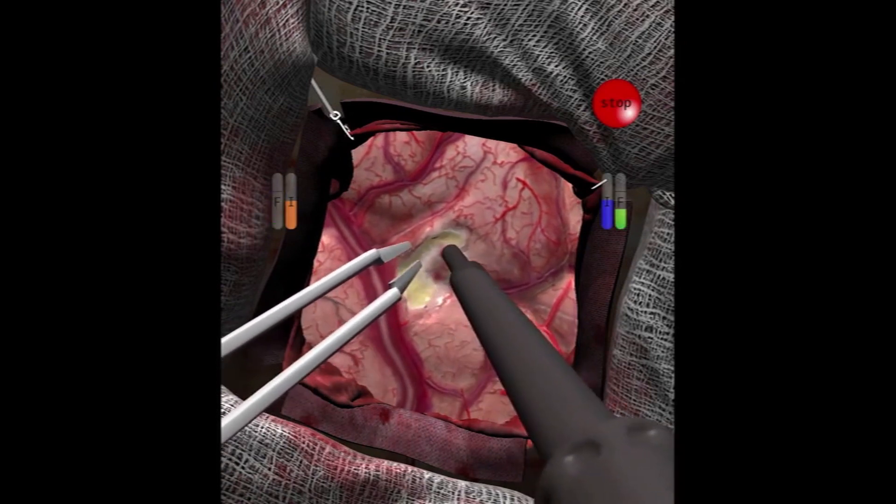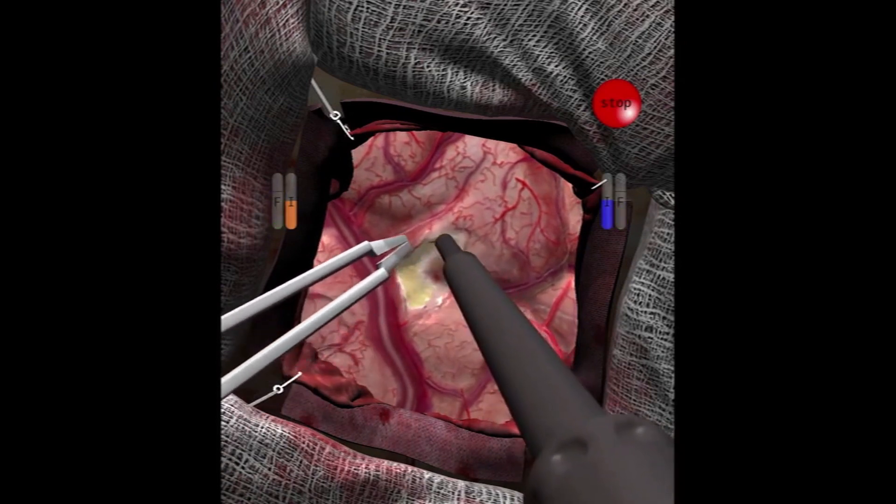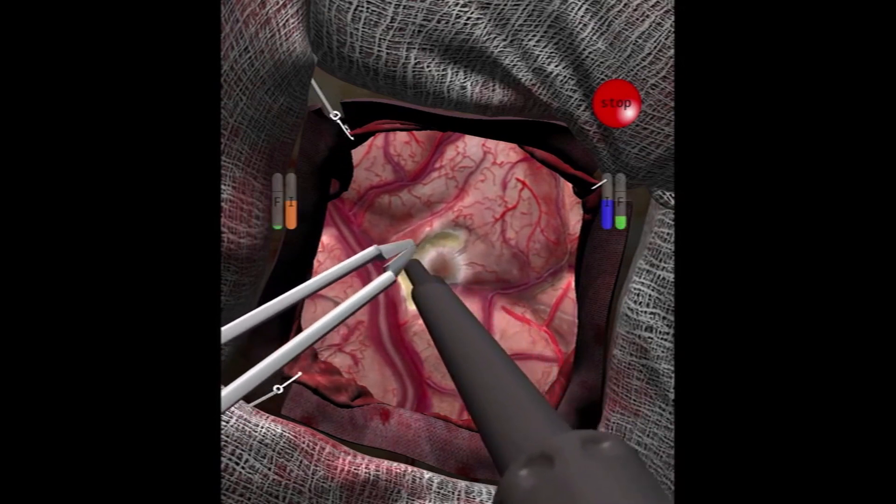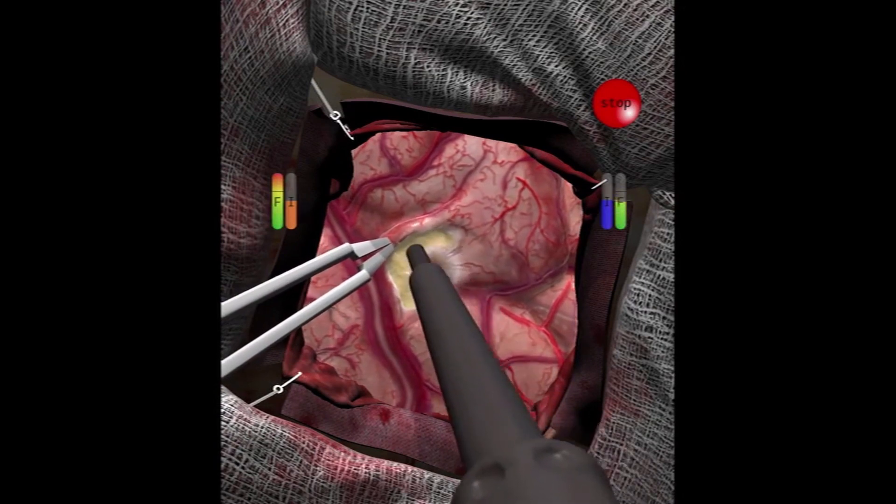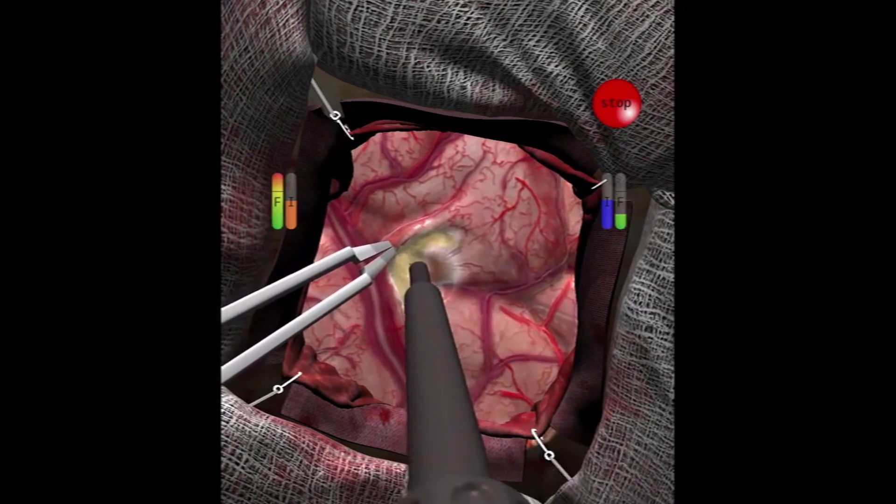Learners are encouraged to integrate the skills they've been practicing in this attempt. This participant uses the bipolar forceps to cauterize bleeding points early on and maintains a clean operative field.